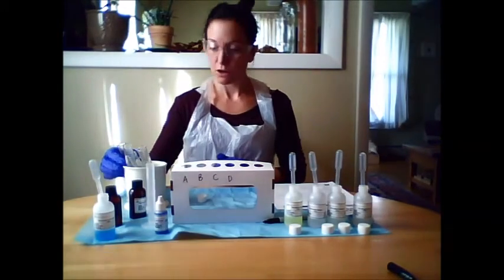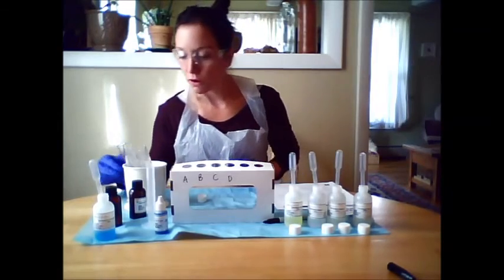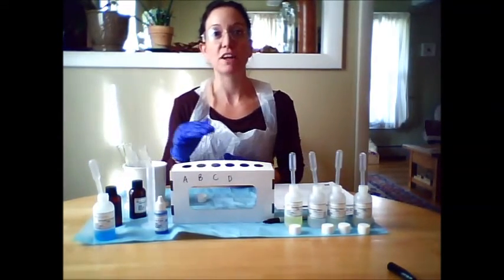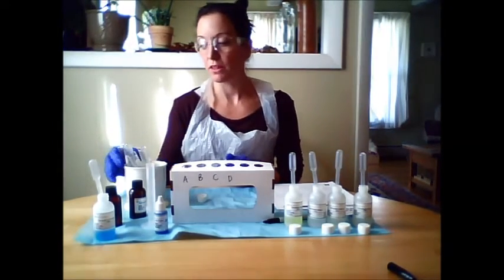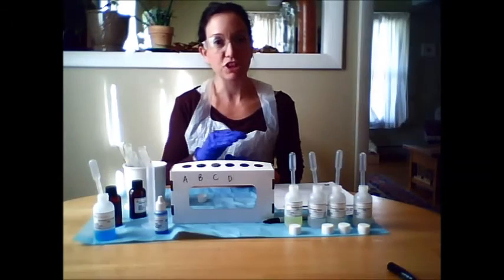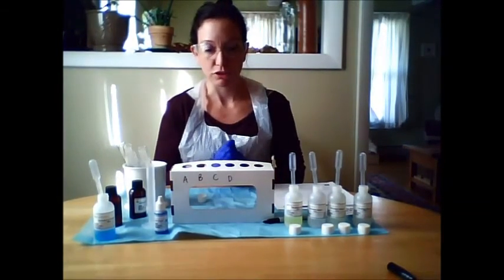Reducing sugar, or sugar, is present in the sample if a red, yellow, or green precipitate forms, and that means you may see the color change just on the bottom of the test tube. It might not be throughout, but if you do see a color change precipitate at the bottom, we know that there is glucose or sugar in the urine.